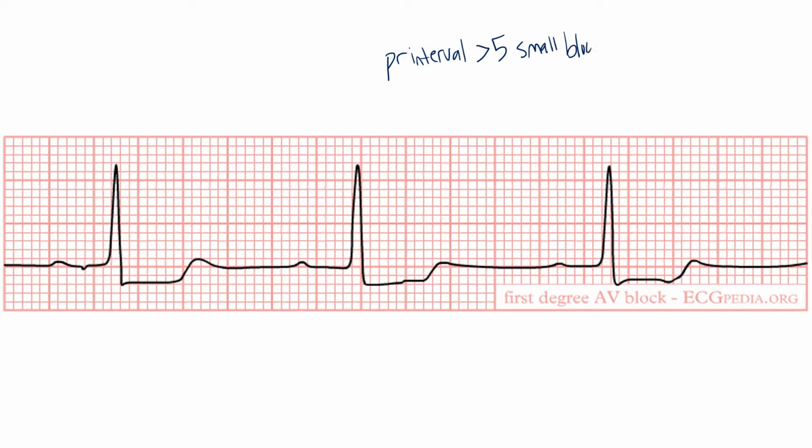What do I mean by that? Let me explain a little bit about an EKG. When you're looking at an EKG strip, there's different parts you have to realize. First of all, there are these large boxes, and you can see how the lines are thicker, darker at the boundaries of the large box. Now, one large box contains, look, 1, 2, 3, 4, 5 equals 5 small boxes.